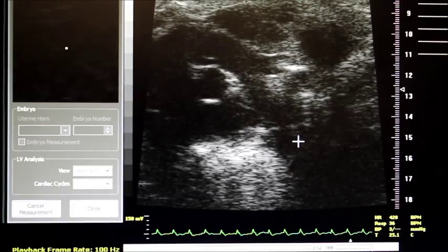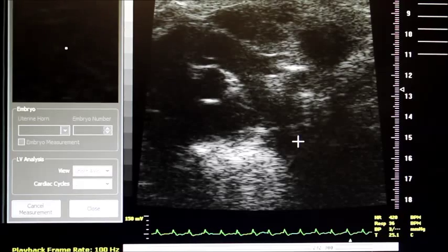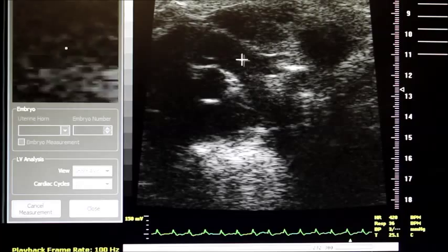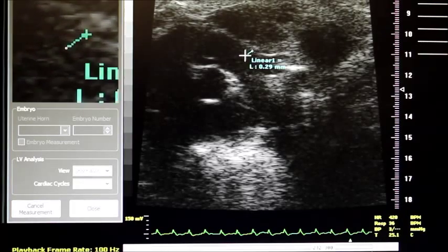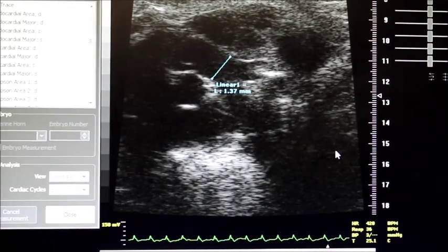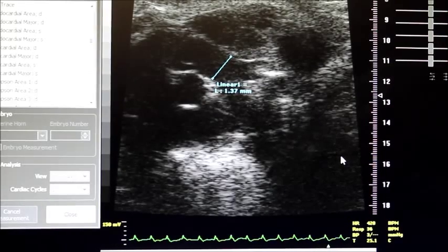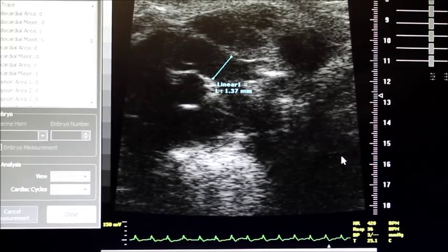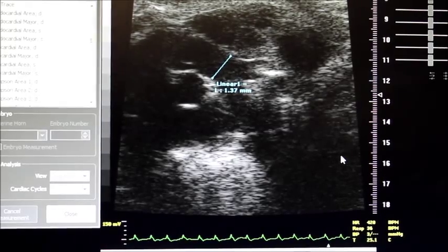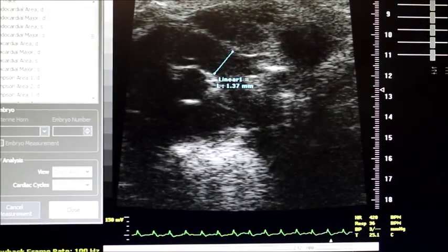For the pulmonary artery, using the movie clip, the diameter is measured at the level of a bifurcation, as it's shown here. Remember that the bifurcation of the pulmonary artery should be measured at the end of the ventricular protosystolic phase and the beginning of the mid-systolic phase, as it is shown here.